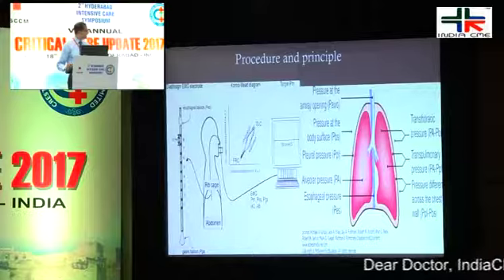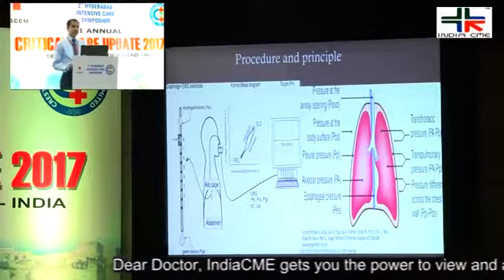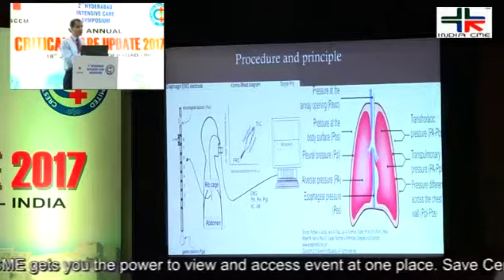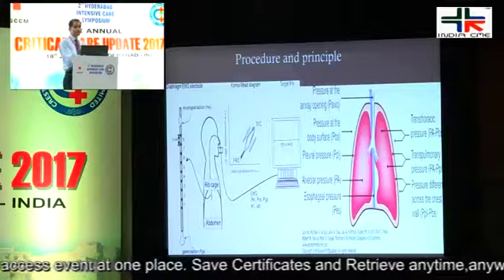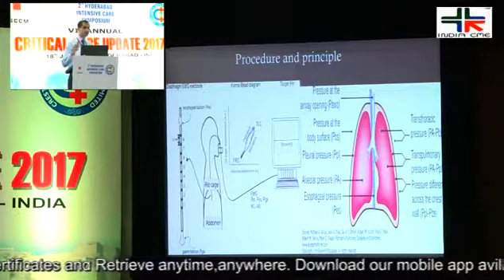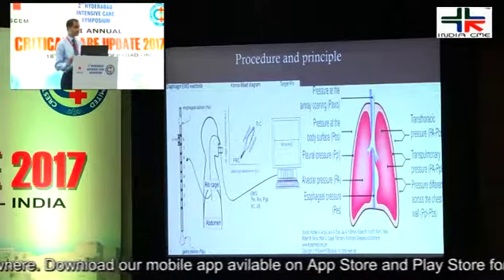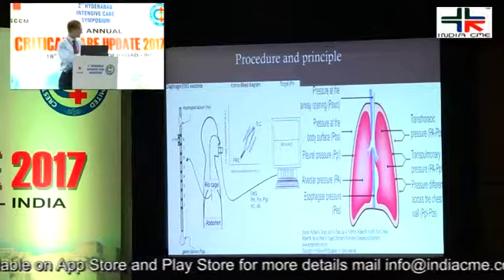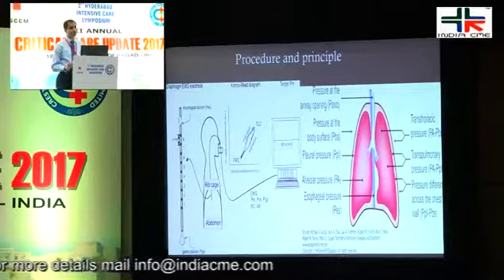The second important thing is that when you inflate the esophageal balloon with air, you see at what level you are getting the maximum oscillations of the pressure in tune with the mechanical ventilation. So if at a particular point you find that the pressure oscillations are the best, that is the exact level at which you need to keep the esophageal monitor, plus of course the fact that that is probably the optimal volume as well.